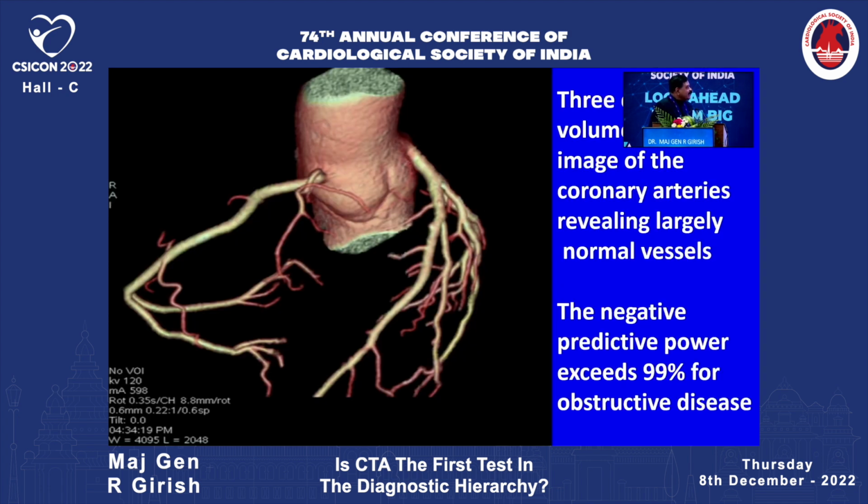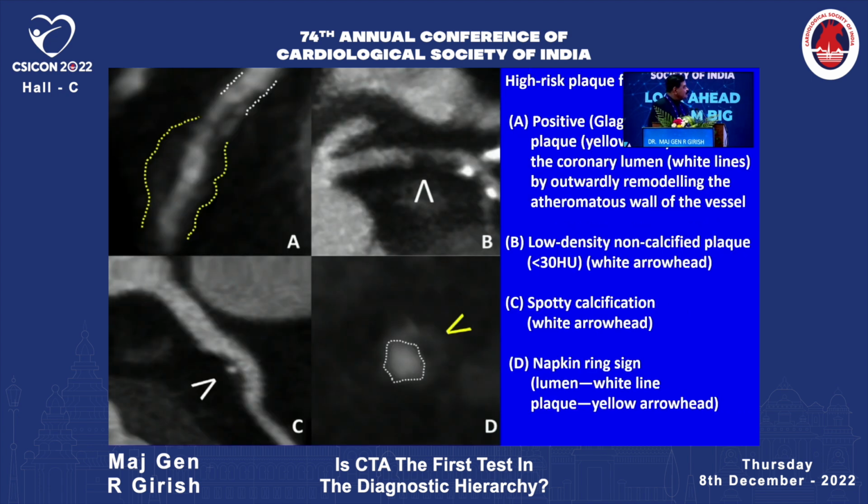It gives elegant three-dimensional pictures and it has a very high negative predictive value for ruling out coronary artery disease.